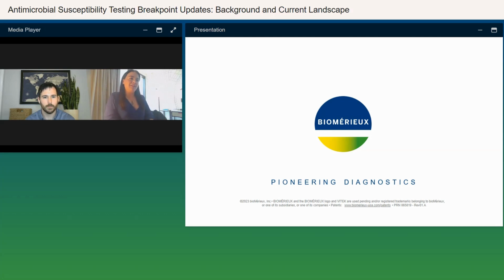So I think that one would really depend. Again, it would be a case-by-case scenario. We'd have to probably look into it a bit more. Happy to dig into that a bit more with folks if needed. The most important thing is whatever comparator you're using does need to be cleared at the breakpoints you're looking at.